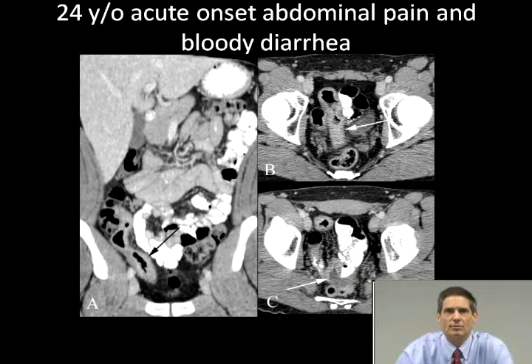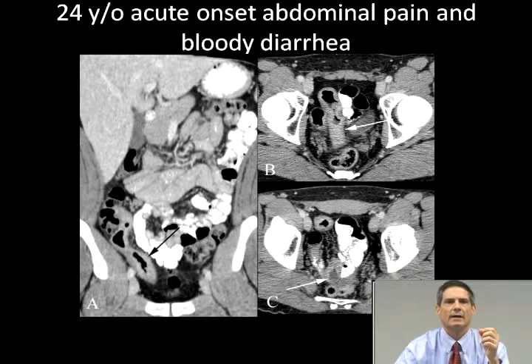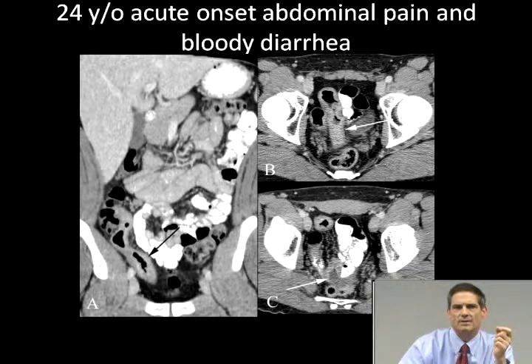Here's a 24-year-old who had acute abdominal pain and bloody diarrhea. The eventual diagnosis was Crohn's disease. Crohn's disease is one of the most frequent indications for a dedicated small bowel study. In Crohn's disease, in addition to the diagnostic initial study, you may do a follow-up study with low-density contrast. That allows evaluation of the bowel wall because you can't see bowel wall enhancement very well when you've got positive contrast in the middle. Again, this is a case where you can add a low-density contrast, either a specific commercially available product or even whole milk. And what you're looking for is the presence, severity, and extent of the disease, and then also to see if there's any extraintestinal complications, fistula, abscess, and so forth like that.